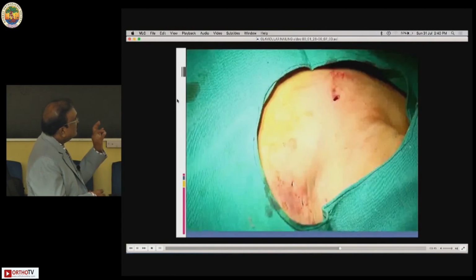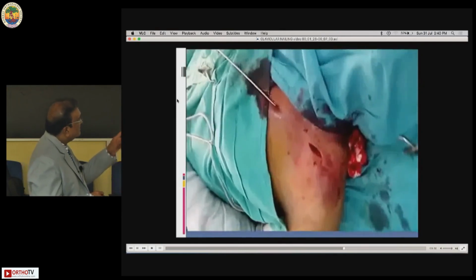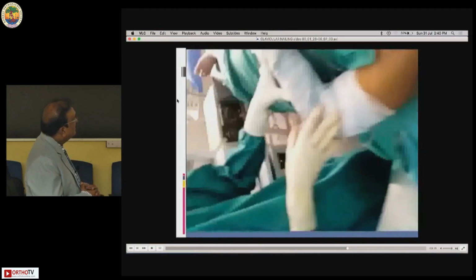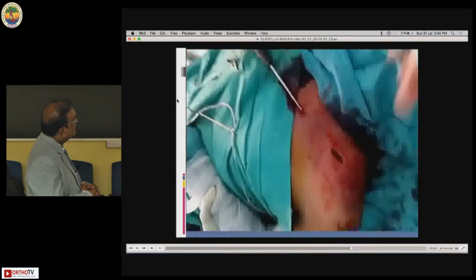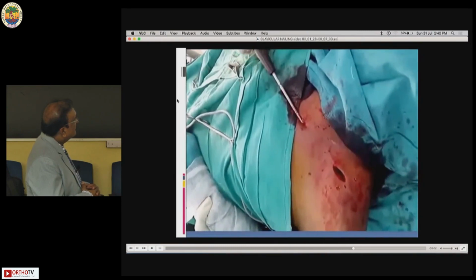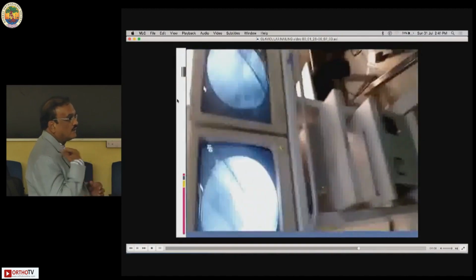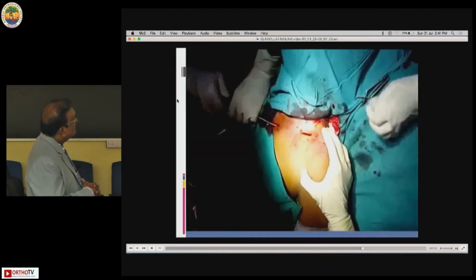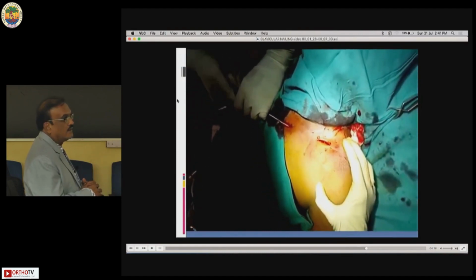And you can see this is the small incision. This is very small. Suppose you are not able to negotiate, give a very small incision, reduce the fracture, and then you can negotiate. Usually the nail ends about 1 centimeter short of the acromioclavicular joint. So you can see, you can compress the fracture site.